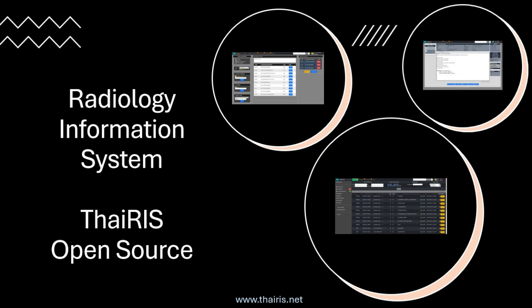Right. While a PACS, that's the picture archiving and communication system, handles the images themselves, storing them, viewing them, the RIS orchestrates the entire workflow around those images. It's managing the patient's journey, right from the initial order for a scan all the way through to the radiologist's findings.